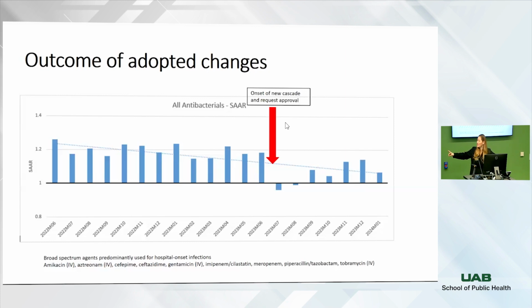Pretty significant change. So we enacted these cascades, and these cascades said, providers, we used to give you all this information, and you were responsible for making the decisions. And now we're literally giving you 1 or 2 drugs that you should use. Not any more, not any less. We're giving you options, and this is what you need to treat your patient with, allergies excluded in those situations.